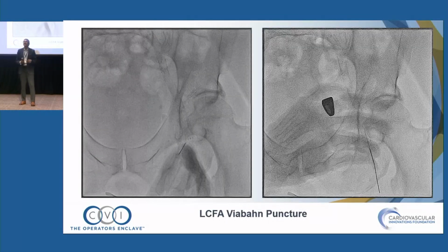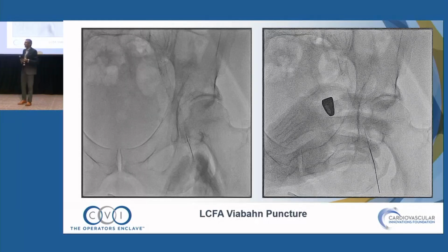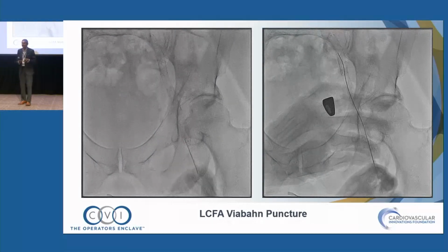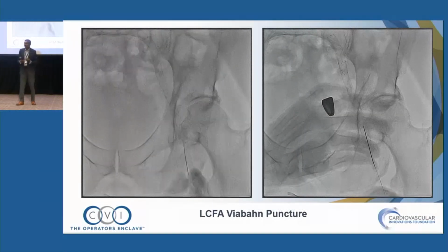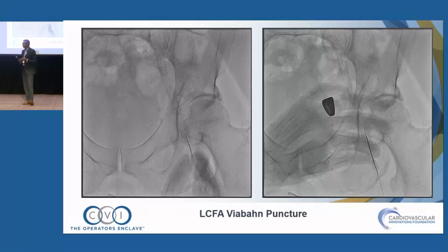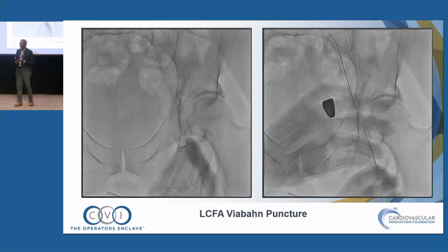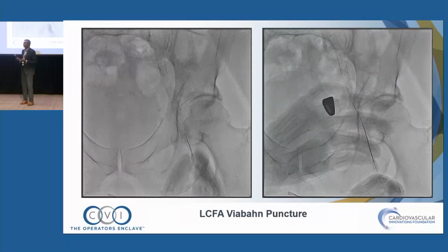The second case and the second concept is, can you actually place a covered stent in a common femoral artery and actually get access in it? Now, it's a highly controversial question. However, if it is well planned and the space between the covered stent's adherence to the vessel wall is minimized with good planning, appropriate therapies with calcium debulking and expansion, and again, these cases have 8 or 9 slides.